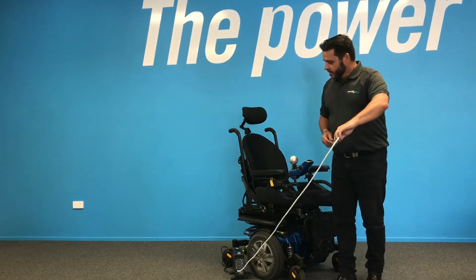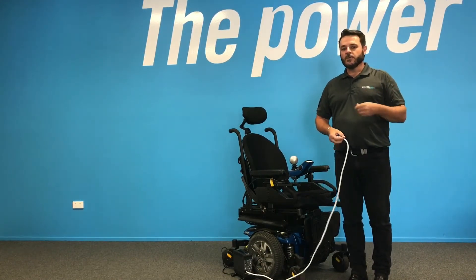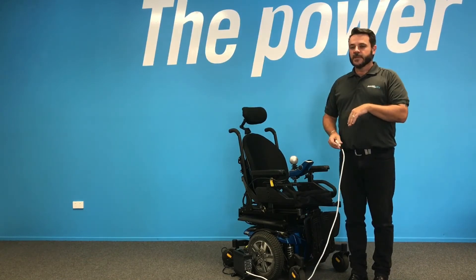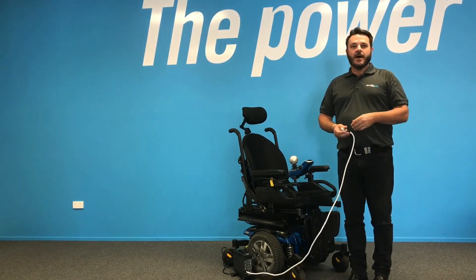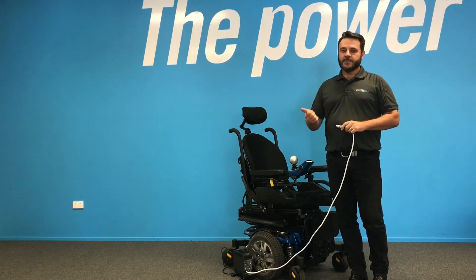The other thing to remember is always use the correct battery charger. With any power chair or scooter, it will always come with a battery charger that's designed specifically for those batteries. If you're using other battery chargers, it can actually damage the batteries or it can damage the charger.